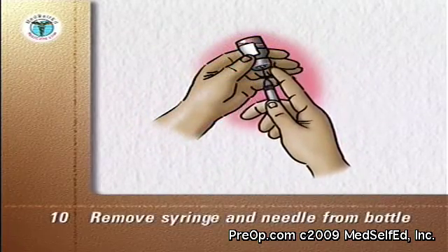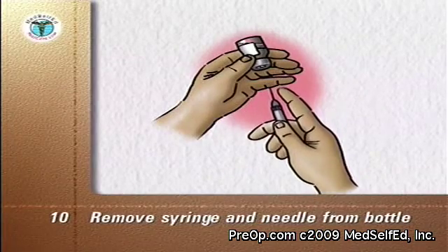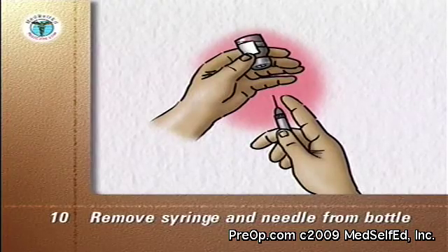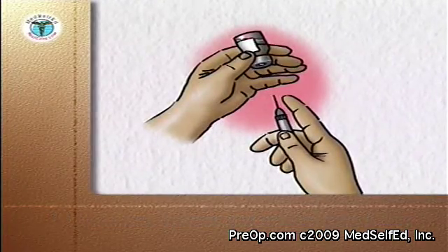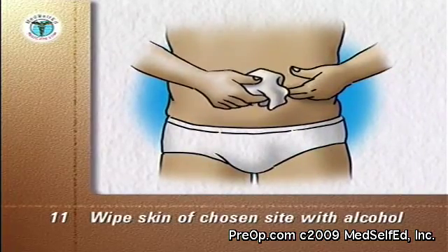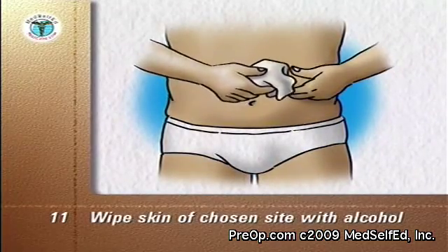Remove the syringe and needle from the bottle. Do not let the needle touch anything else before it touches your skin for the injection. Wipe the skin of the chosen injection site with an alcohol swab and let the skin dry.